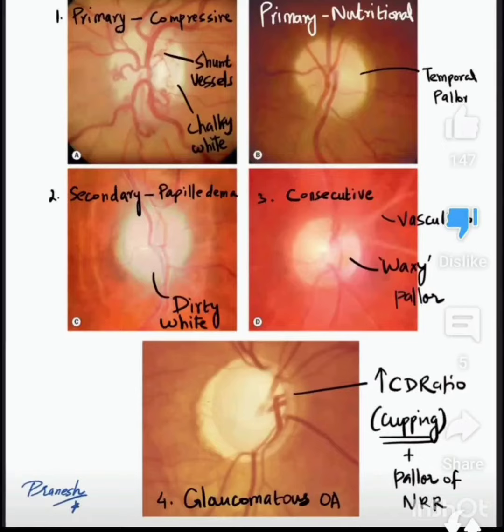And fourth, the most common is glaucomatous optic atrophy. Here we see the cup-disc ratio increase and pallor of the neural retinal rim.